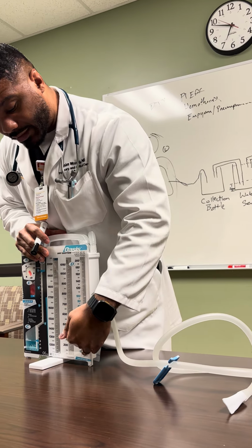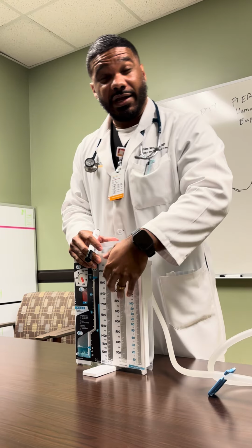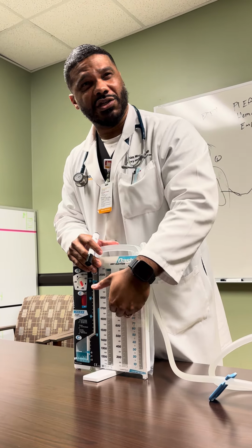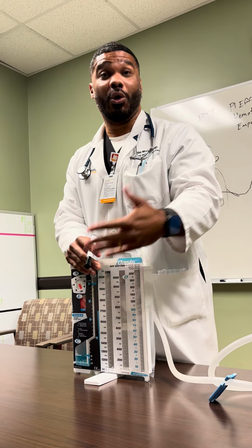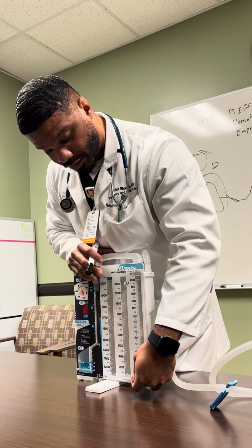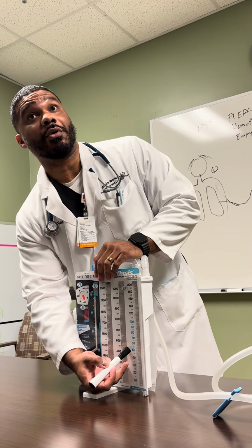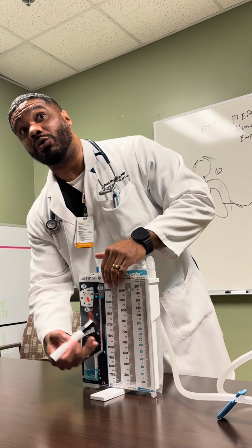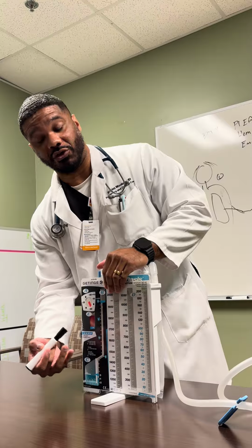A good way to ensure that we are documenting apples to apples is that when you go in, you assess where the level is at the end of your shifts. When do you usually check, at the end of your shifts or at the beginning? Beginning of the shifts? Both? Okay. So usually at the end or the beginning of the shift, one of the nurses will come in here, see where we're at, make a mark, and it would be super helpful if you record the date, the time, and the amount drained during your shift. Okay? Date, time, and the amount drained during your shift.